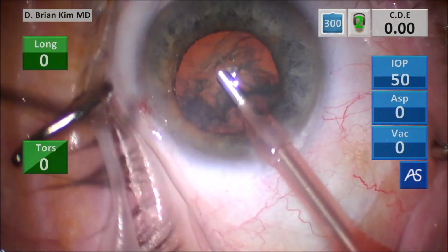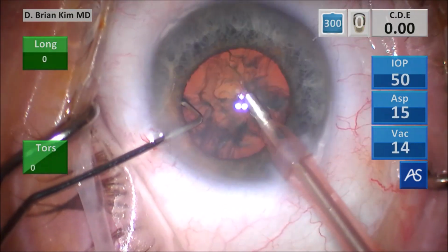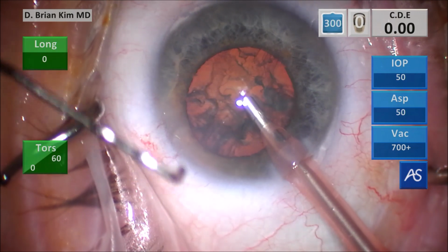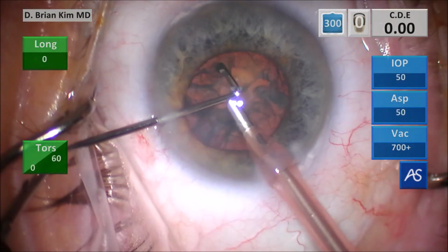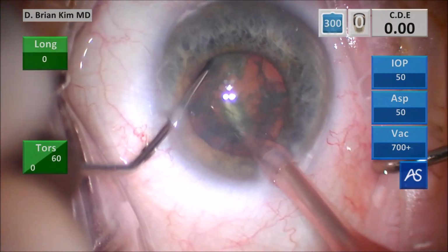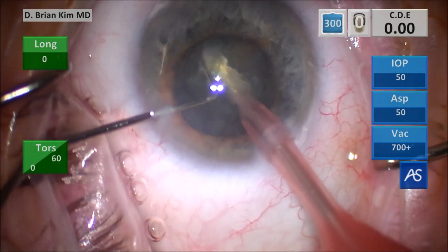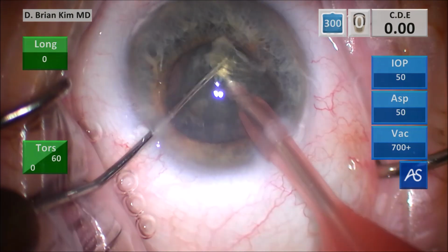So I place my instruments into the eye, but as soon as I activate the vacuum, look at the pupil, it starts to spasm on me. I place the chopper under the rhexis edge contra-incisionally, pointing the phaco tip vertically sub-incisionally, crushing and dividing the lens. That's double chop. I place the chopper around the right heminucleus, pulling it centrally toward the phaco tip, and that is cross chop. Now the lens is divided.